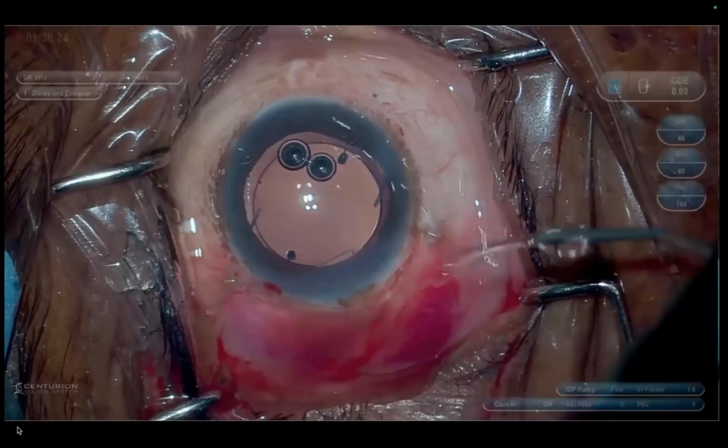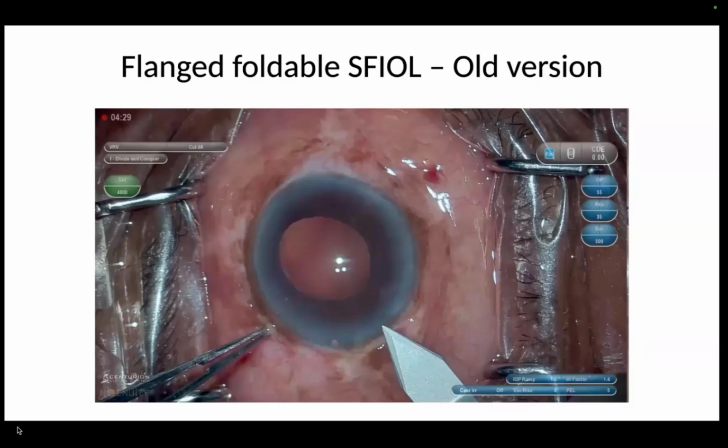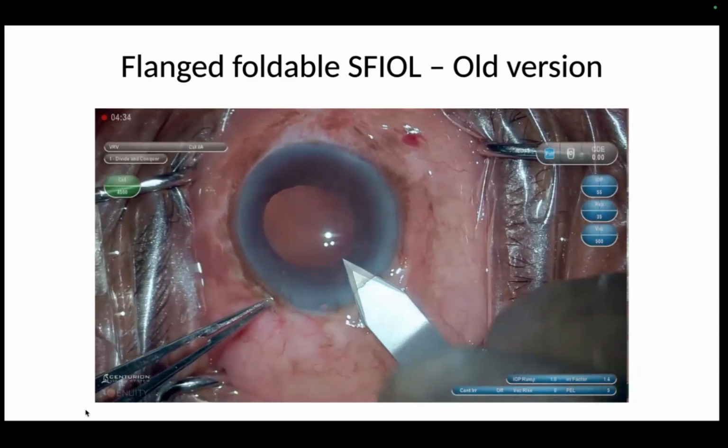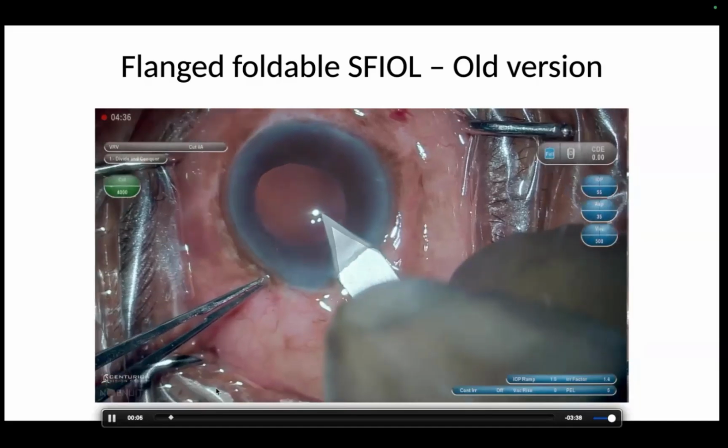So moving on, what do we do in cases where there is fibrosis of the conjunctiva, and a lot of previous surgeries have been done? So we can do the flanged IOL with the foldable intraocular lens as well. So I'll just quickly go through this video. This is what I used to do.